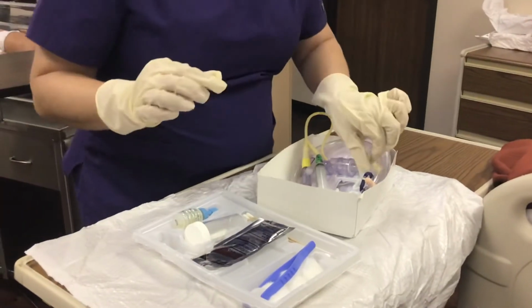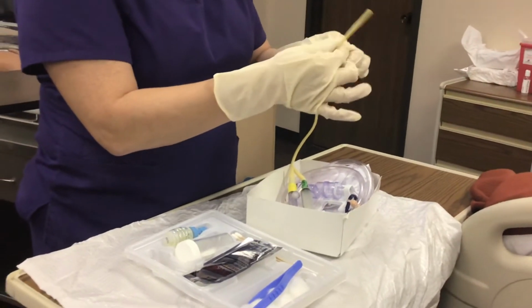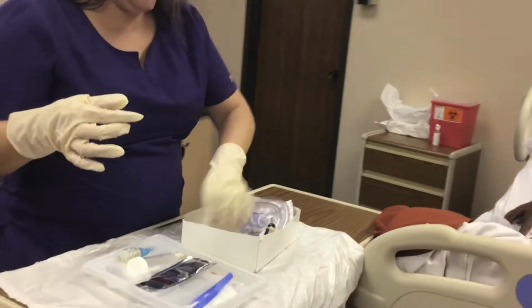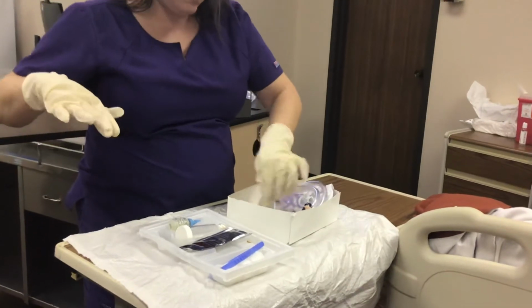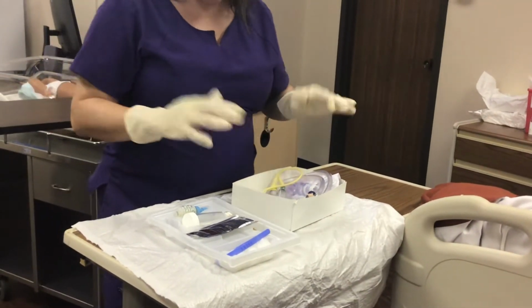Okay, I'm going to take the catheter tip 3 or so inches, and I'm going to get it all lubed all over without hitting myself or coming out of the sterile field. Okay, I'm going to leave that right there.